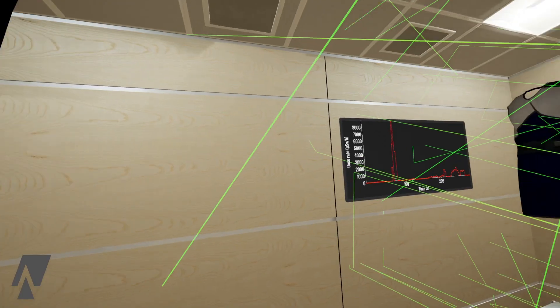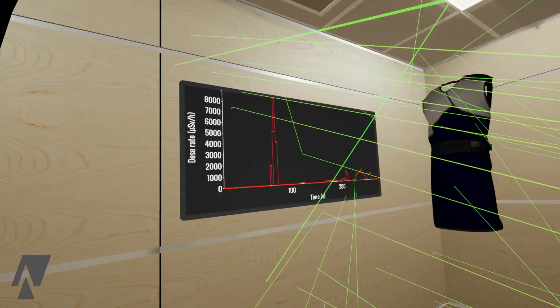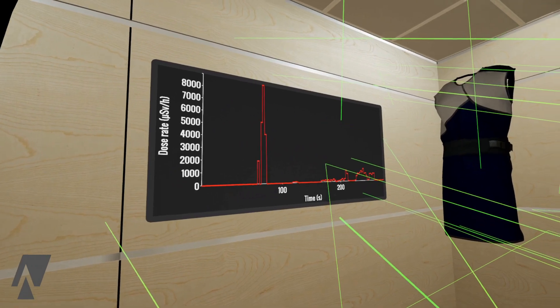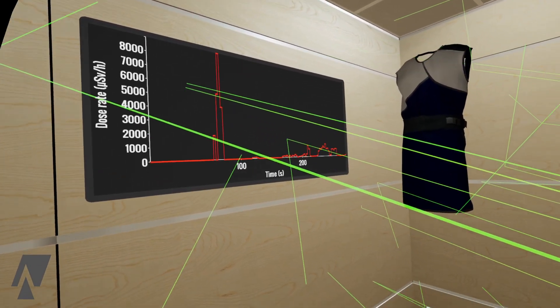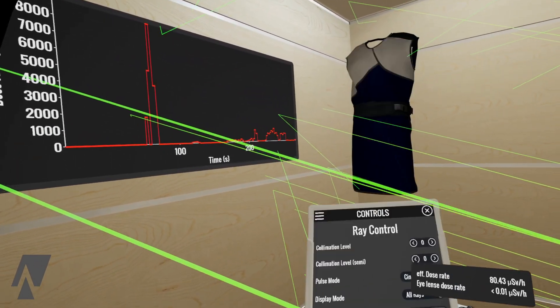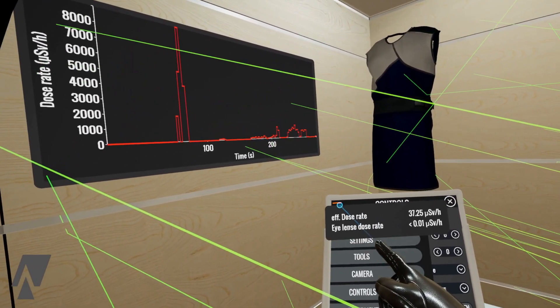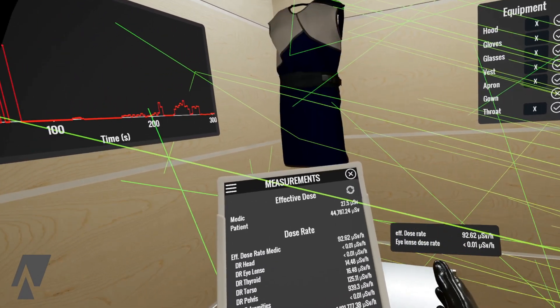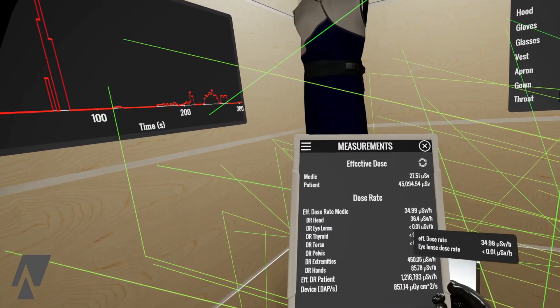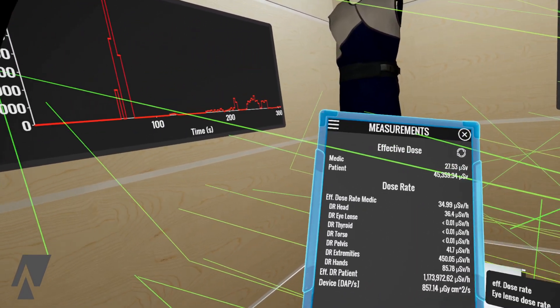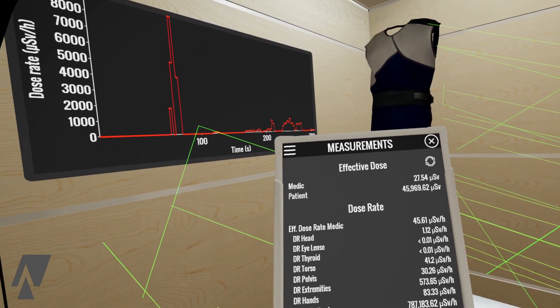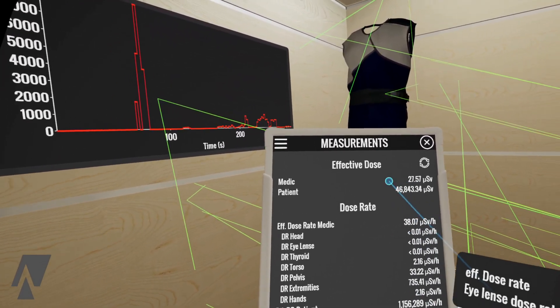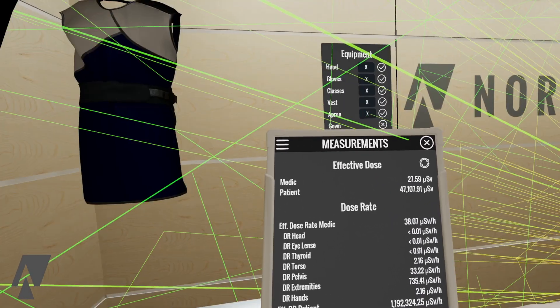Lastly, over here there's a little graph showing the dose rate over time. I can also bring up a more detailed version of my measurement widget, which gives me more detailed measurements for all the different body regions of myself and also an overall dose of the patient.